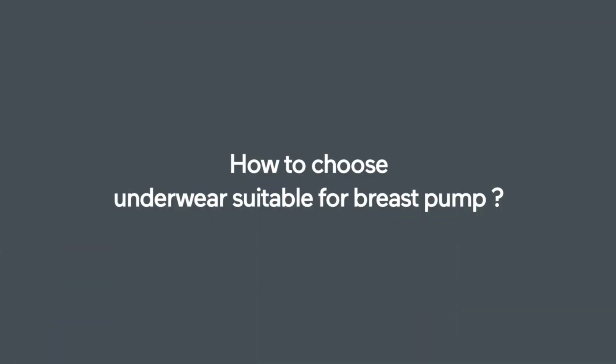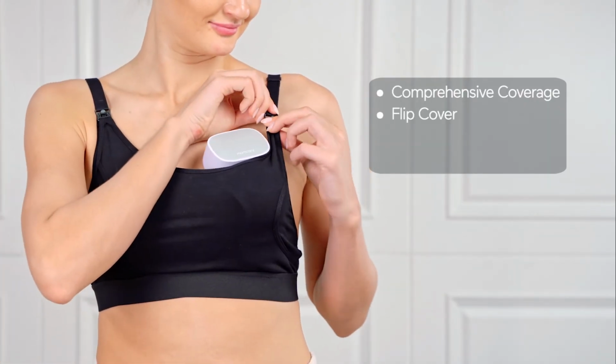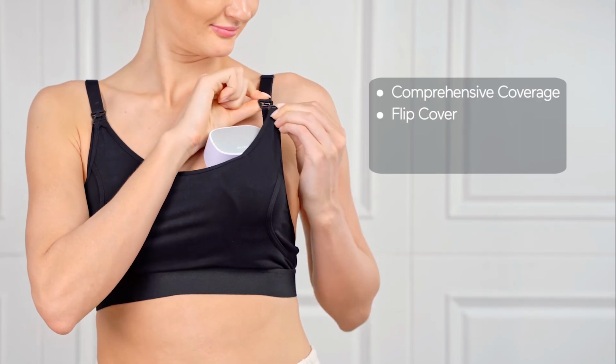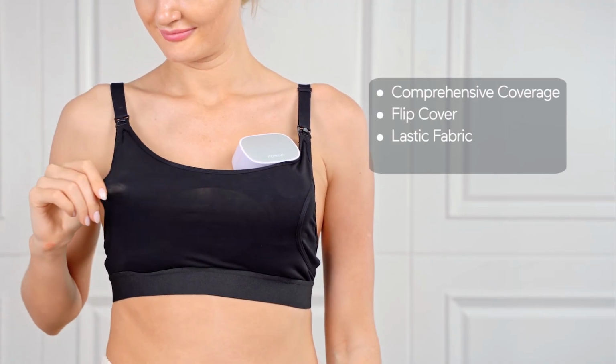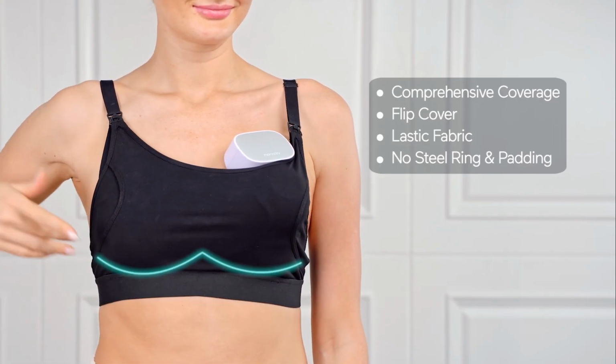How to choose underwear suitable for breast pump. It is recommended to wear these 4 underwear styles when using a breast pump: comprehensive coverage, elastic fabric, flip cover, no steel ring, and padding. Make sure that the flange fits the breast when pumping, and the underwear straps are tightened to ensure that the breast pump is stable.